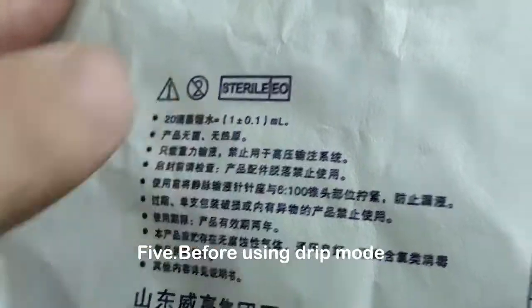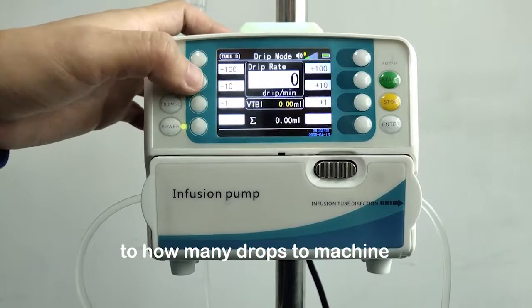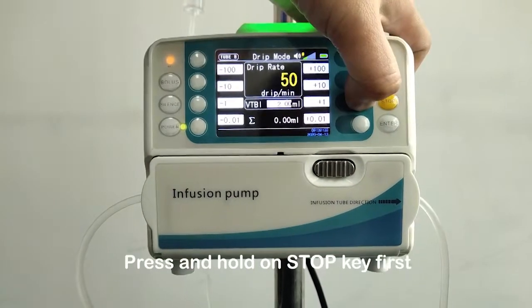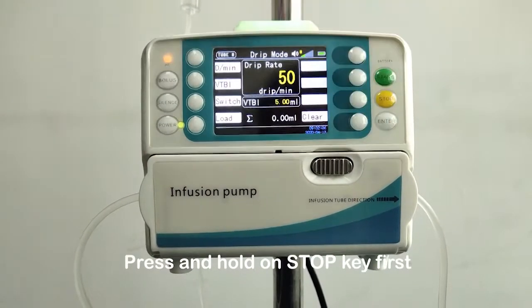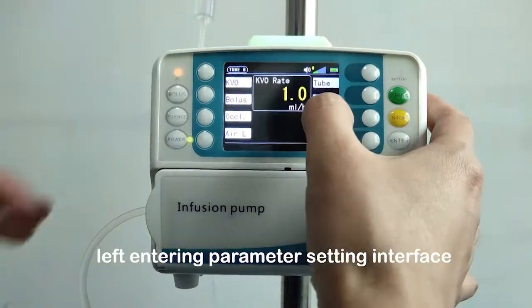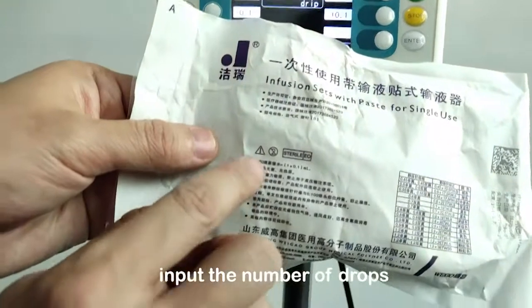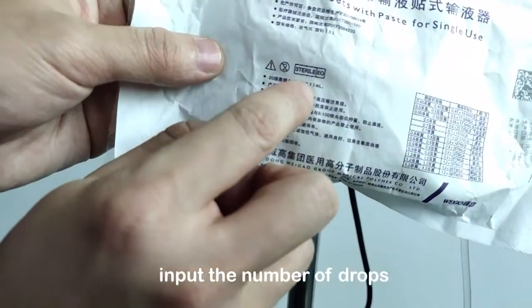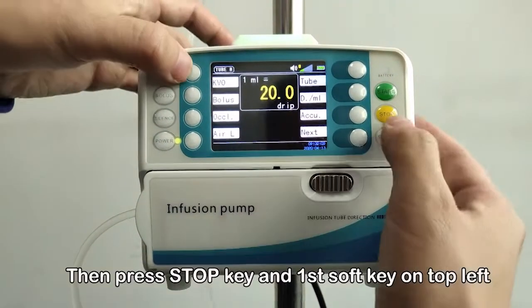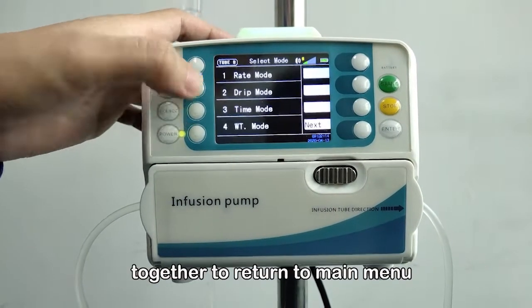Before using drip mode, input how many drops are equivalent to 1 milliliter. The number of drops is found on the packaging of the infusion set. Press and hold the stop key first, then press the first soft key on the top left to enter the parameter setting interface. Press the D/mL soft key, input the number of drops equivalent to 1 milliliter, then press the enter key to save and exit. Then press the stop key and first soft key together to return to the main menu.